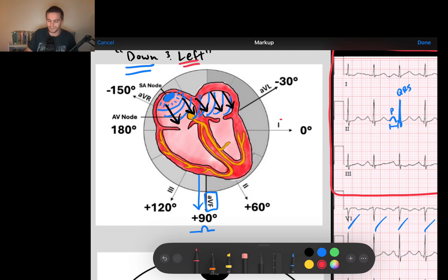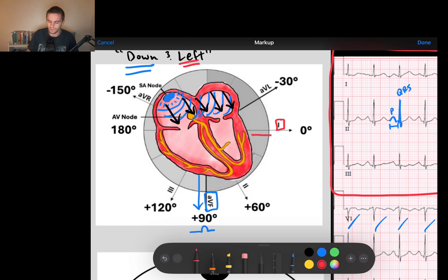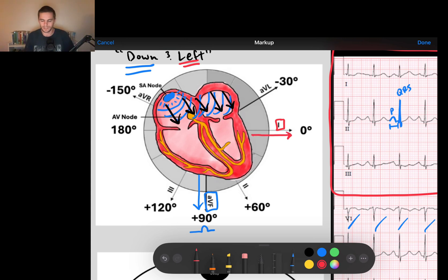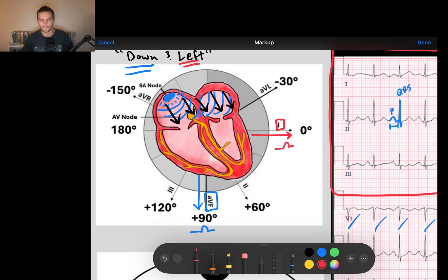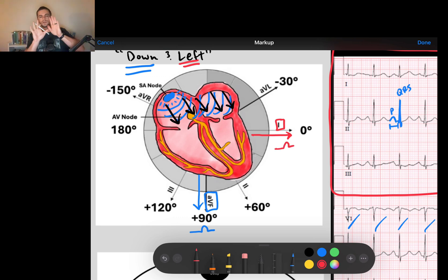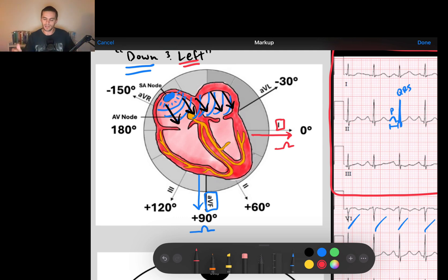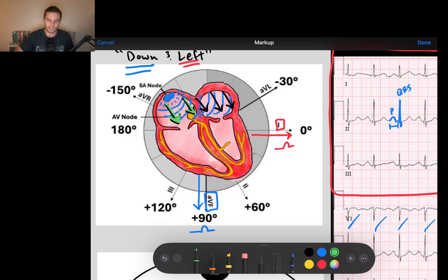Also, if they're heading to the left, well, my leftward facing lead is lead 1. And so anything that's heading towards the left from right to left, which we know our sinus P wave should, then we will have an upright P wave in lead 1. And that's essentially kind of our two perpendicular angles that if they're positive, we know that signal within the atria is heading down and to the left.